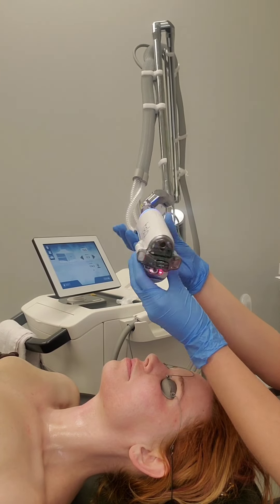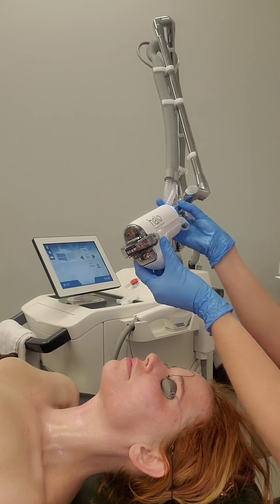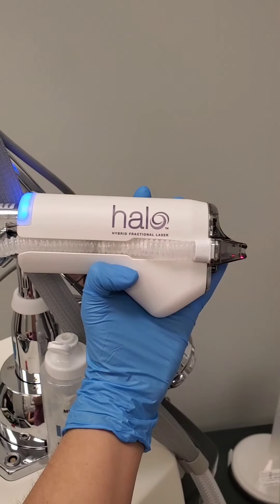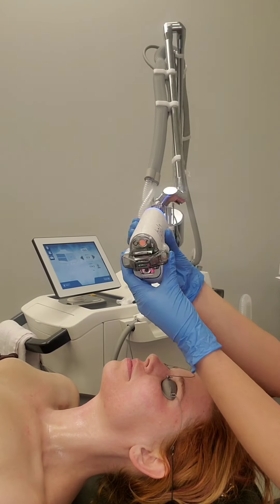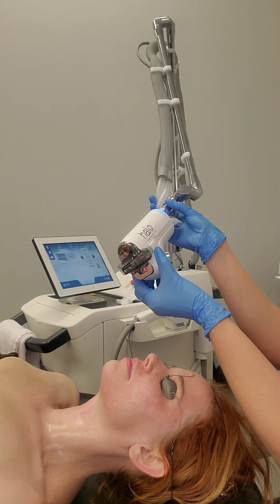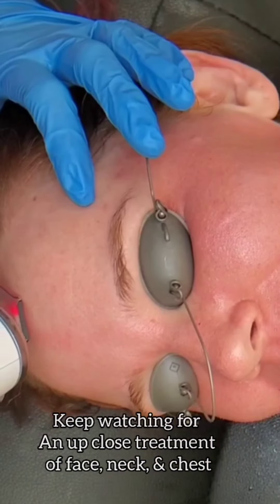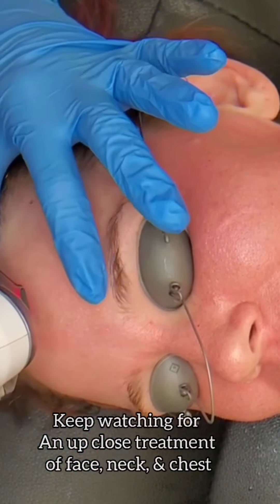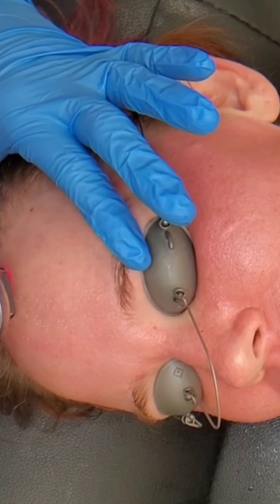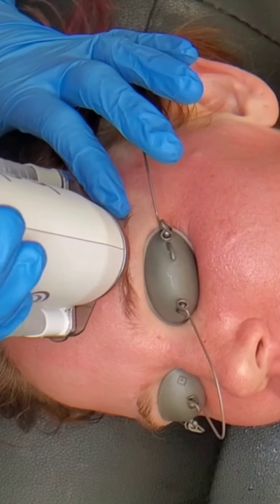As you can see, it has some tubing on the side — it's really awesome and I'm going to tell you why. This device has two hoses on the side: one is designed to deliver the cooling from the Zimmer Chiller, which is super cold air that makes the treatment so much more comfortable for the patient. The other tubing connects to your Buffalo smoke evacuator, which is sucking up any smoke and dead skin cells — and you get a ton of dead skin cells with the Halo.